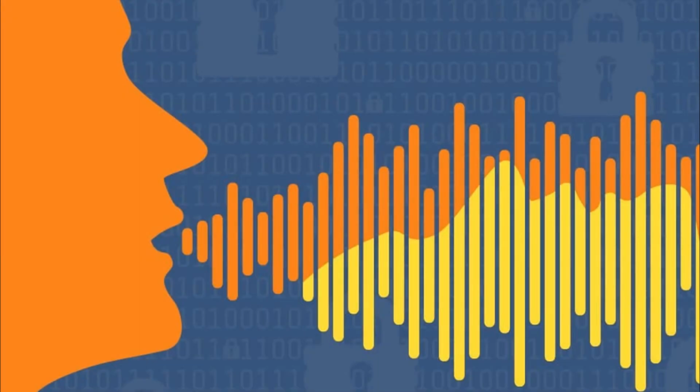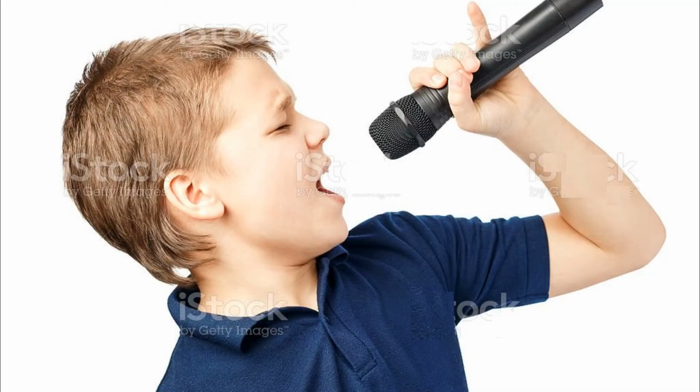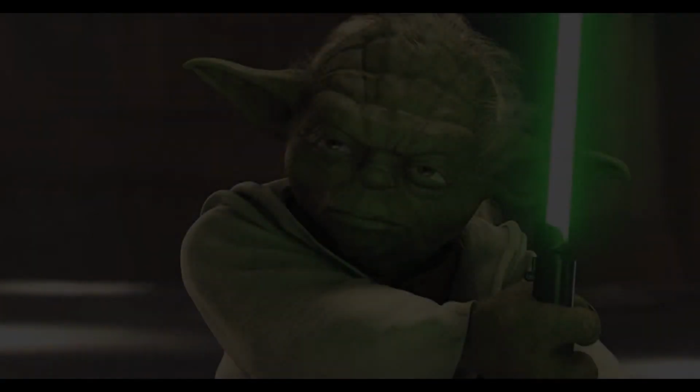I discovered other voices. I even have a few funny voices I use when I try to be funny, like Yoda, Queen Elizabeth, and a little kid singing.